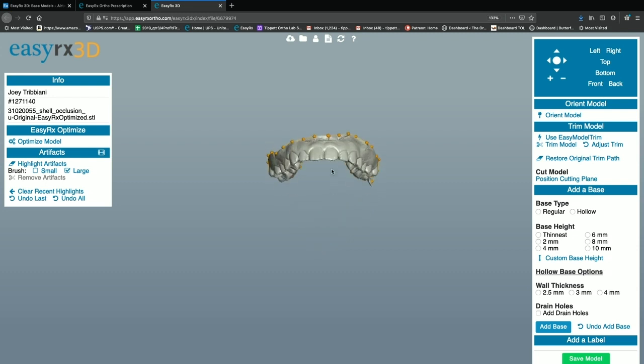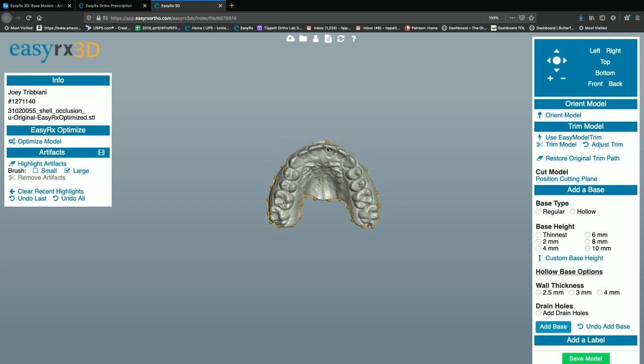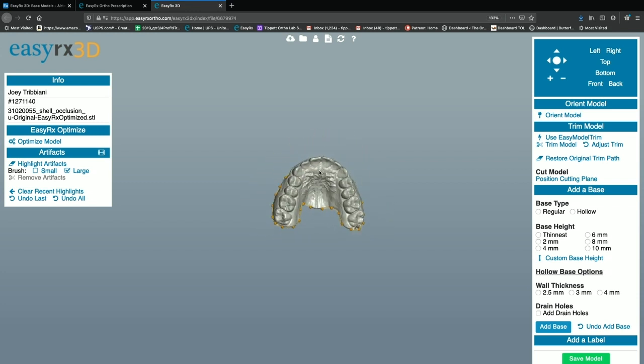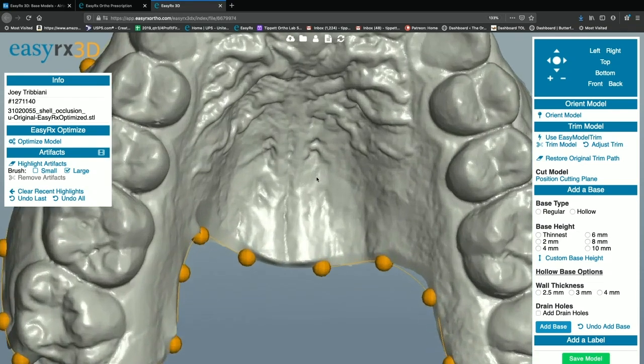So I'm using my left click. Usually on Meshmixer, you've got to use right click to move it around like this. But I guess since it's in a web browser, it's a little bit different. So then there's my left click. I can look around. I can use the mouse wheel. I can zoom in on it.